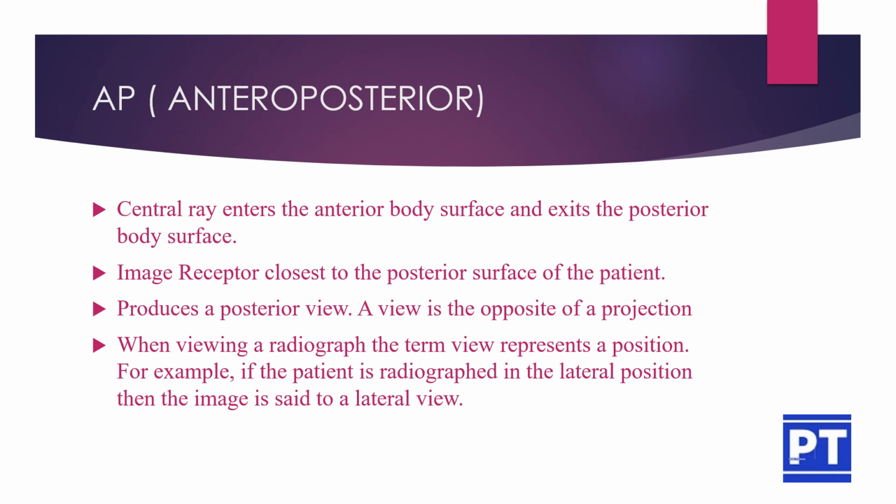When viewing a radiograph, the term view represents a position. For example, if the patient is radiographed in the lateral position, then the image is said to be a lateral view.